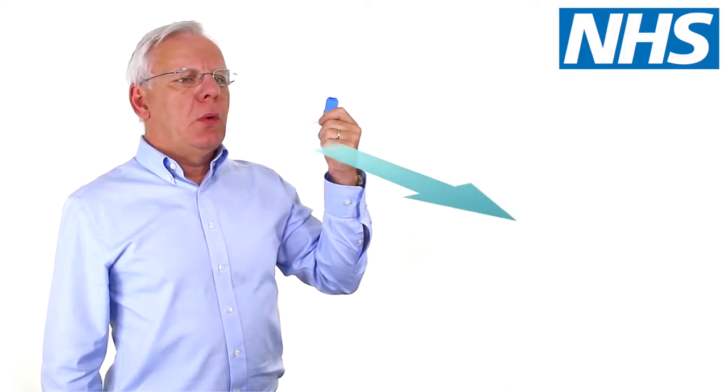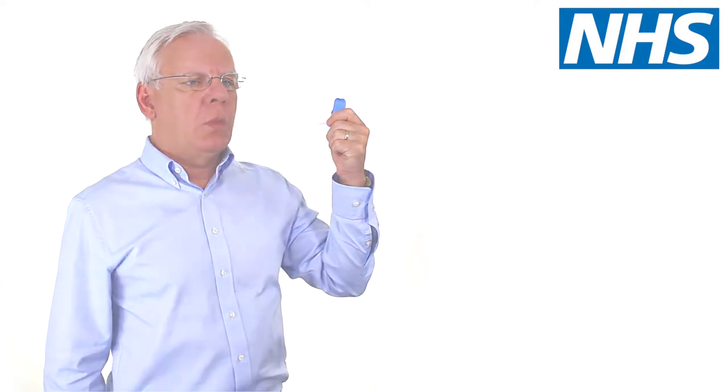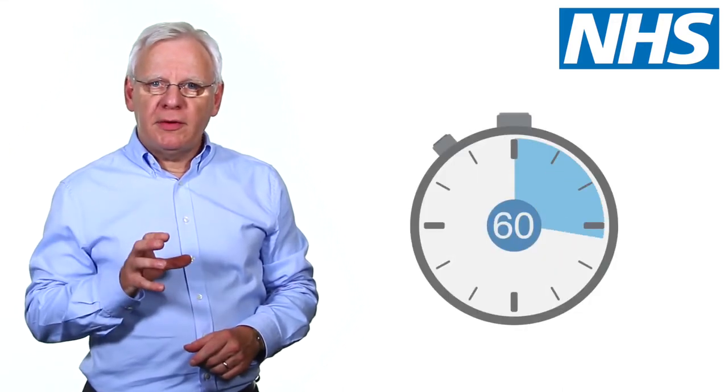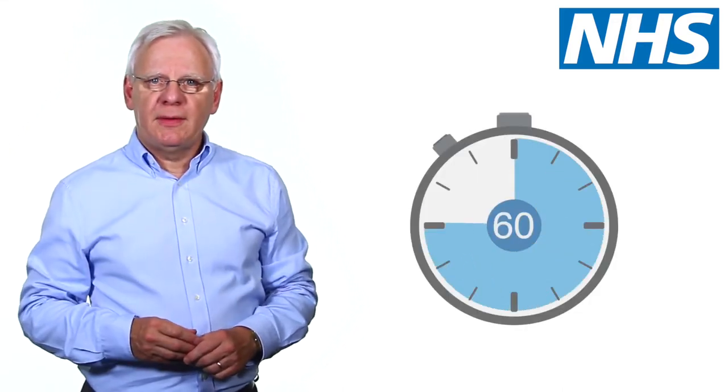When you can no longer hold your breath, breathe out slowly. If your doctor has told you to take two puffs of the medication, wait for one minute before repeating the procedure. Make sure you shake the inhaler firmly before you begin.